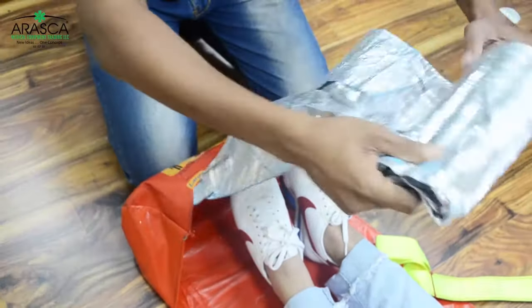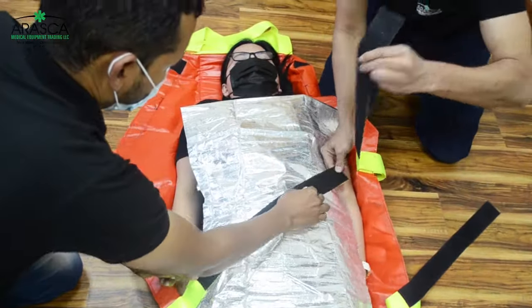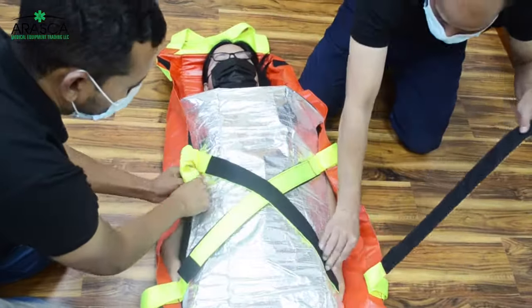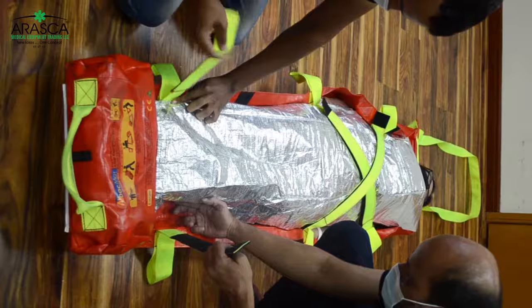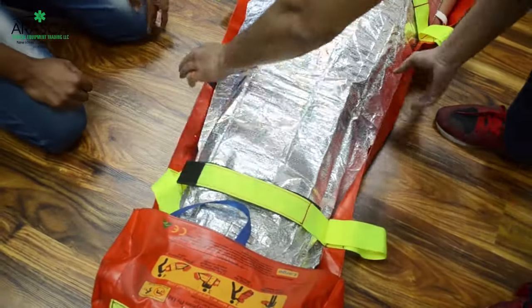The responders can then choose whether or not to use the thermal blanket stored under the foot pocket, which is used to protect the patient from heat. The thermal blanket can also be used to secure the body of panicky patients before attaching the body and feet straps.